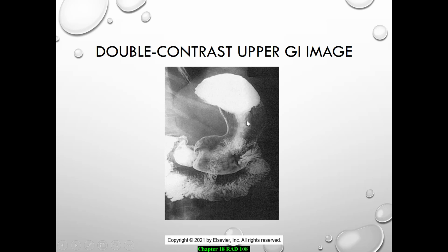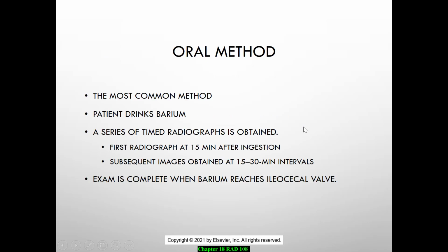So here's the barium, but look at how nicely now we can see those structures inside the stomach with the gas. Small bowel studies can take a while. They could take up to an hour. They could take 24 hours.